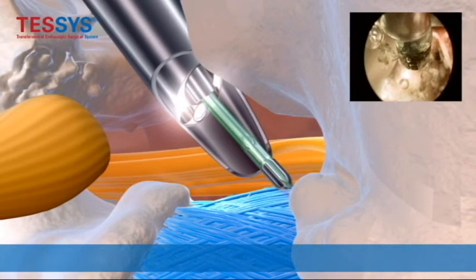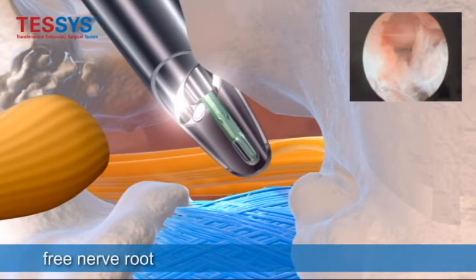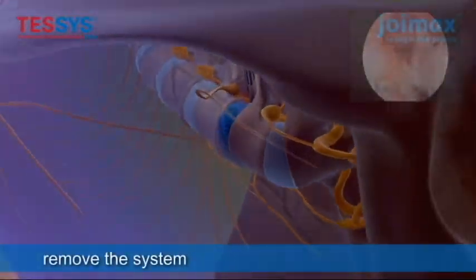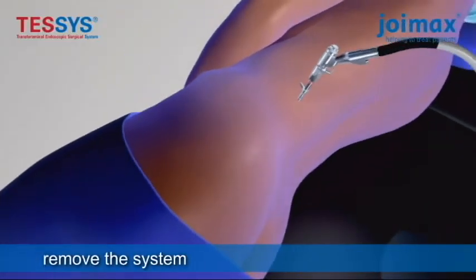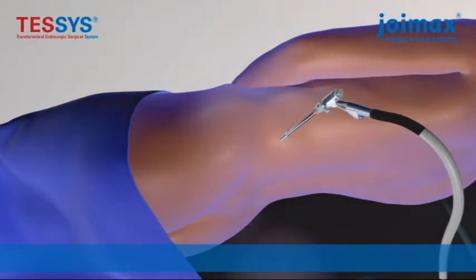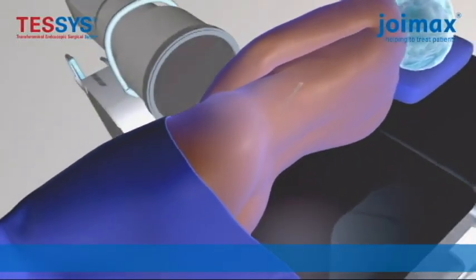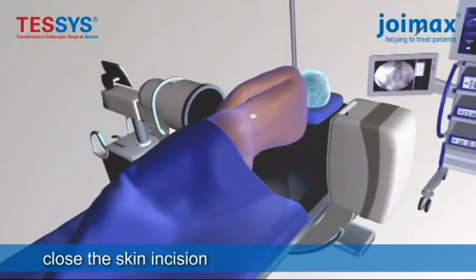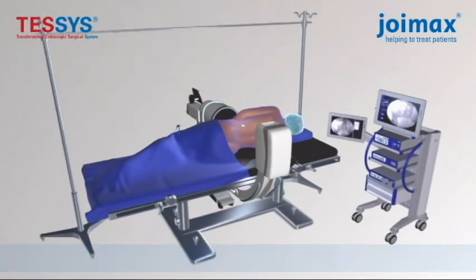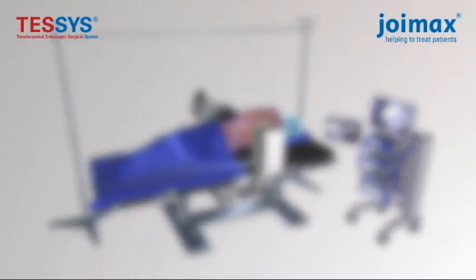Once this is done, you inspect the area and make sure all the nerves are free and the surgery is complete. The incision is closed with an absorbable suture and a band-aid is placed. The patient is then brought to the recovery room and discharged home the same day. At the Jasper Spine Institute, this procedure is done all under local anesthetic with sedation and no general anesthesia.